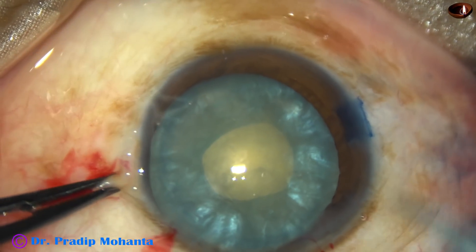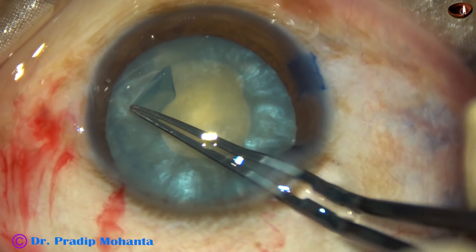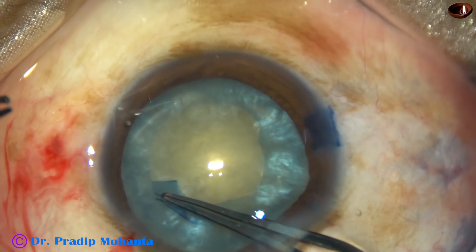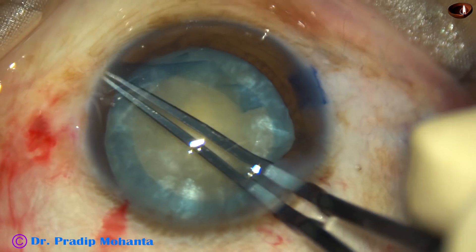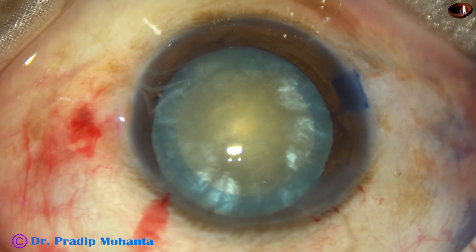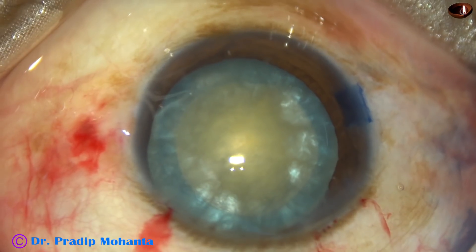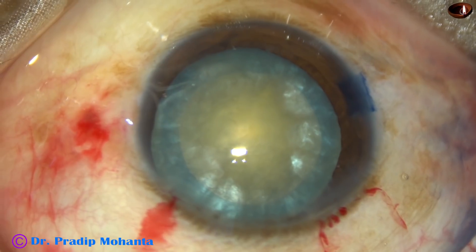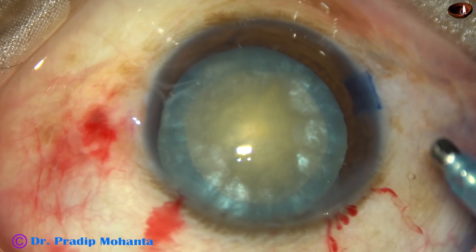And now I am taking visco again. A small cut is made at the margin of the mini-rexis. This is known as Mohanta's rexis by many of my colleagues, though it is not invented by me. I did it in my own way, but long back, many years back, Dr. Gimbel has done this. Since I have used it many, many times, it is known as Mohanta's rexis to my colleagues.